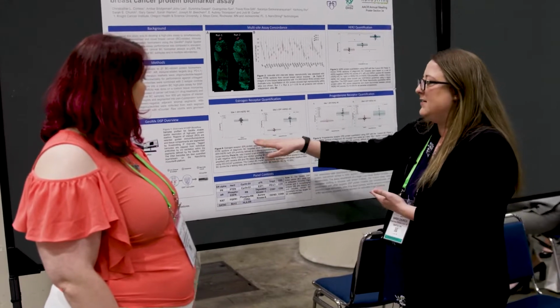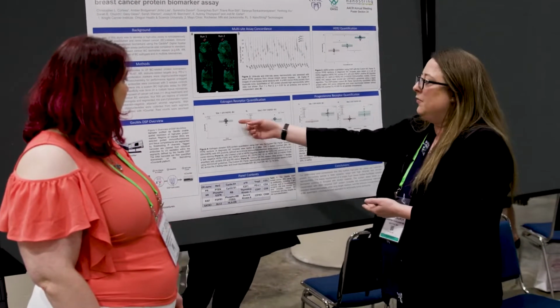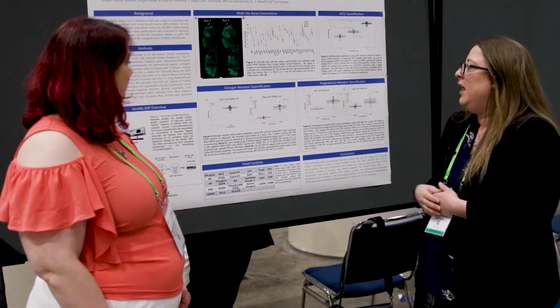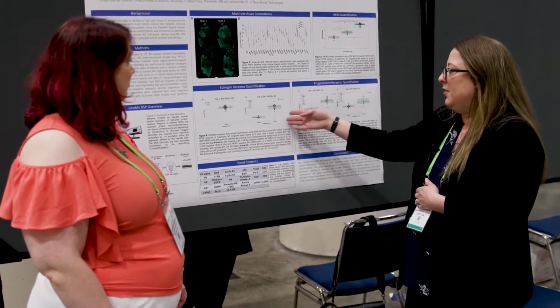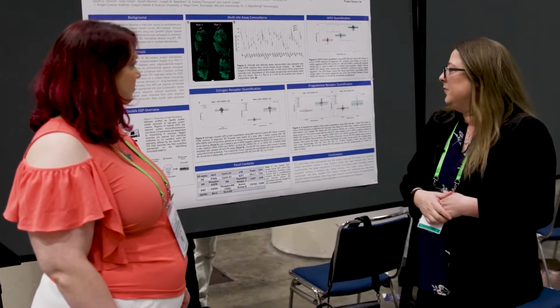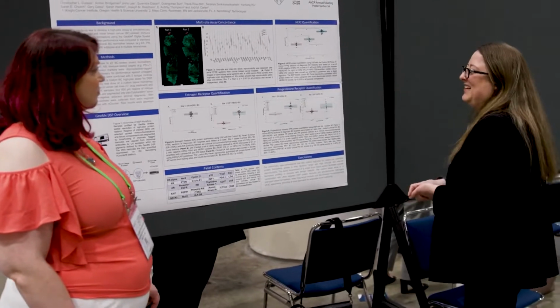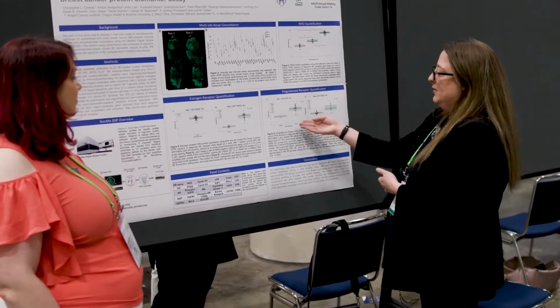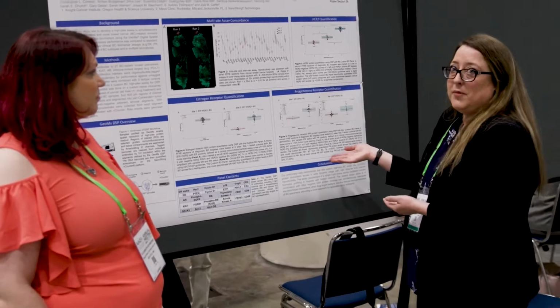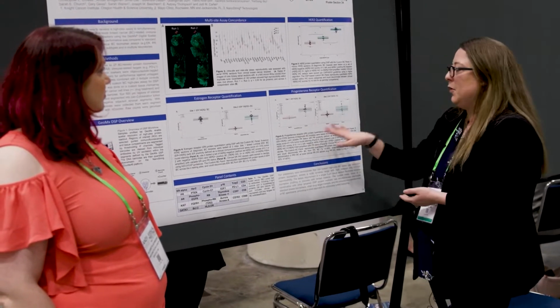When you correlate that to the IHC ER, we have really, really high expression of ER based on our DSP assay. And then similarly in this cohort, the positive samples are much, much higher than those that are negative. And then very similarly in the progesterone receptor, you see that those that were positive have really high PR in the GeoMx assay compared to the negatives in both of those cohorts.